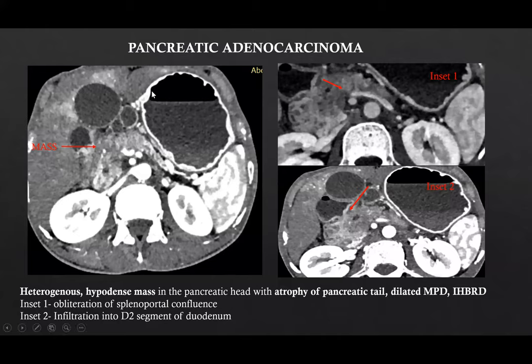Coming to the individual cases, this was a case of pancreatic adenocarcinoma. Here we can see a heterogeneous hypodense mass in the pancreatic head with atrophy of the pancreatic tail and a dilated MPD. There is associated IHBRD. In inset 1, we can see that there is obliteration of the splenoportal confluence, and in inset 2, we see that there is infiltration into the D2 segment of the duodenum.